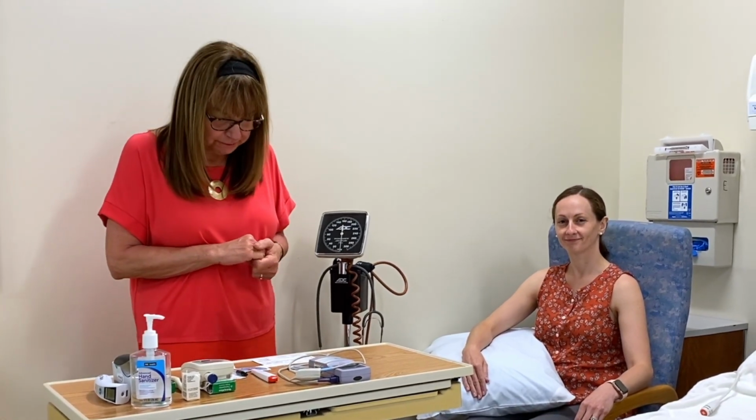Remember that when you're taking temperature, and today I'm going to demonstrate, I have 4 mechanisms of measuring temperature on the patient that I have here today, which by the way is Monique Belize, and she is a recent graduate of our program who is now a registered nurse.